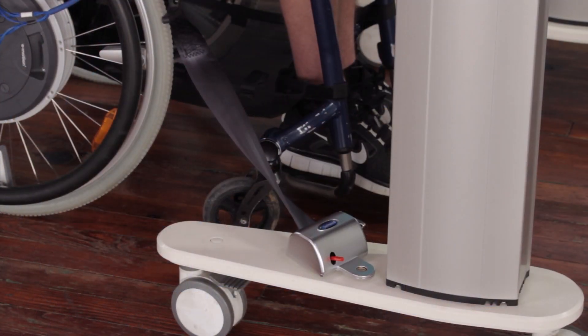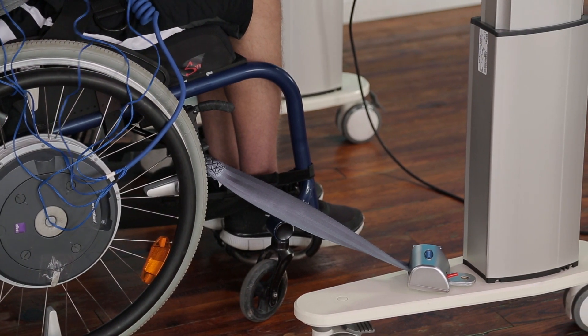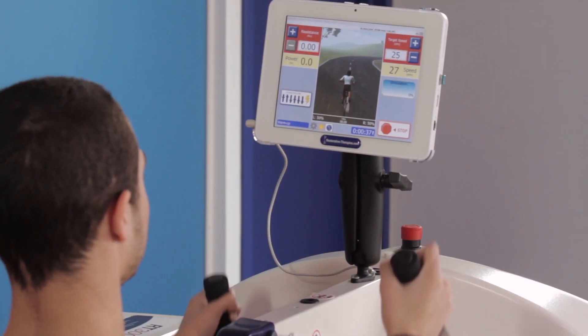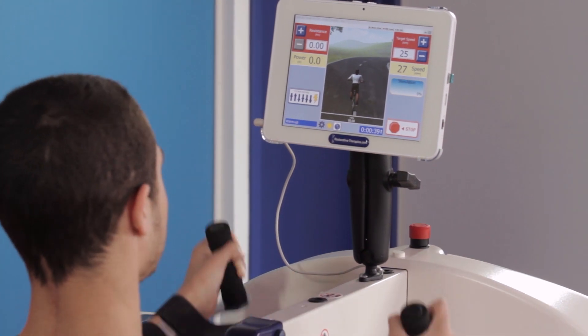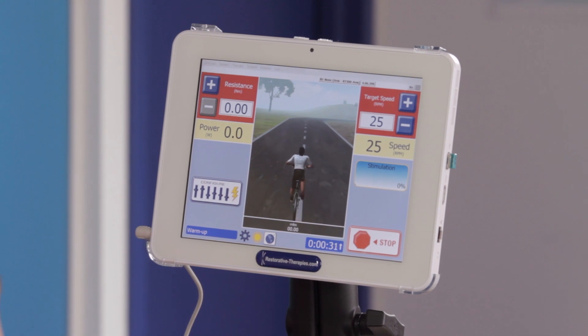These restraints hold the wheelchair or other cycling surface securely in place during a therapy session. The RT300 is controlled by our SAGE controller, which has an antimicrobial touch screen and engaging therapy animation.